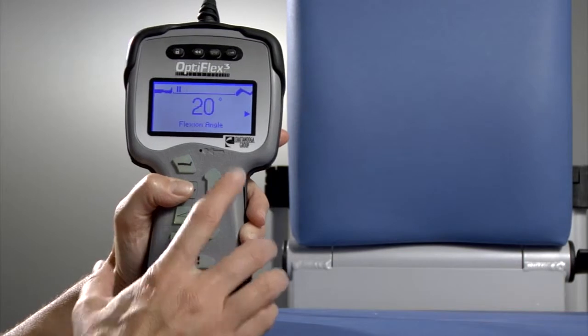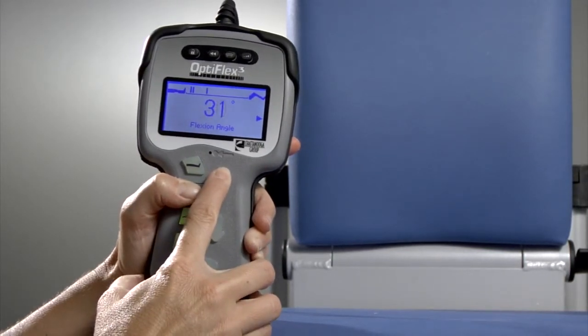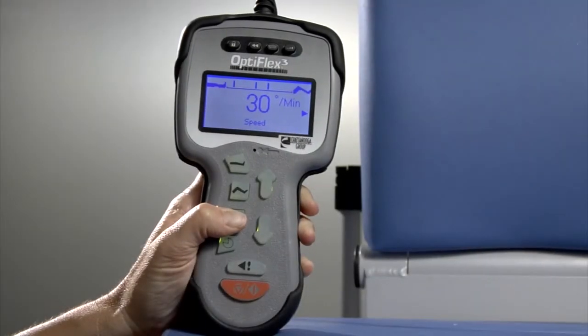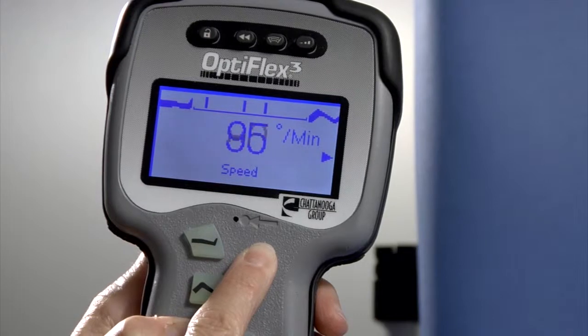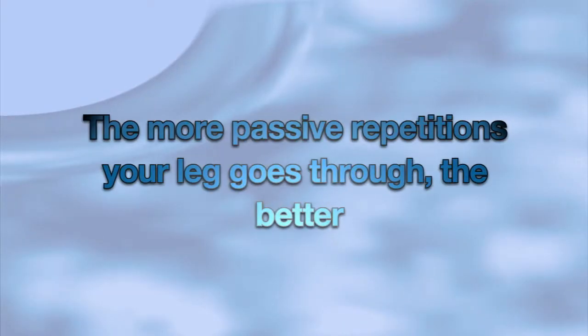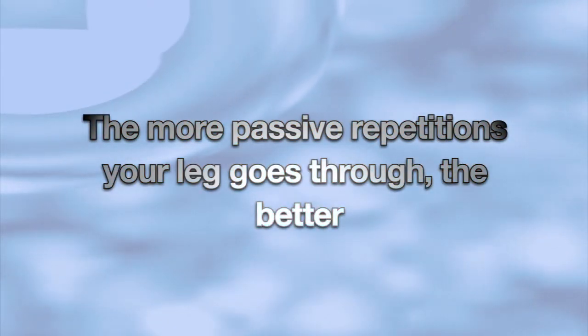To adjust the flexion setting, hold down the flexion button, which is symbolized by the picture of a bent leg. Set your desired flexion limit by using the appropriate arrow. To adjust the speed, hold down the speed button and adjust using the appropriate arrow. The speed is measured in the number of degrees the machine will move per minute. Find a speed that is comfortable, keeping in mind that the more passive repetitions your leg goes through, the better.